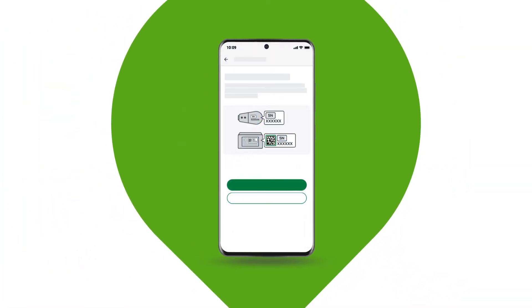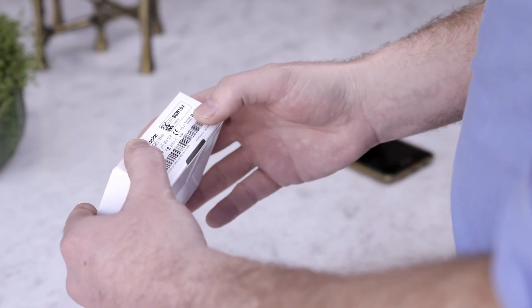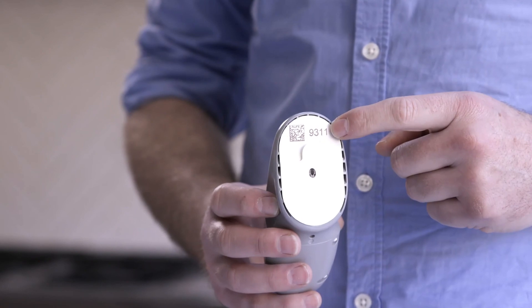Enter your transmitter serial number. The serial number can be found on the bottom of your transmitter box. Then enter your sensor code — the sensor code is on the sensor applicator.